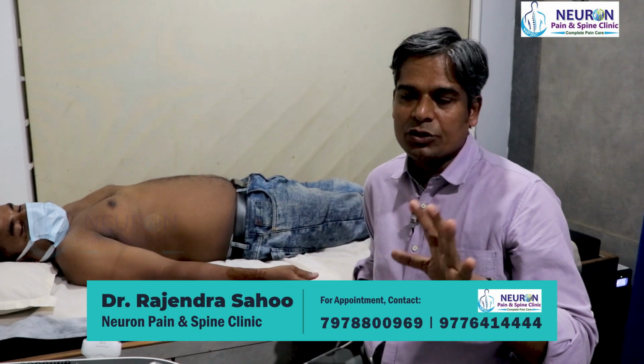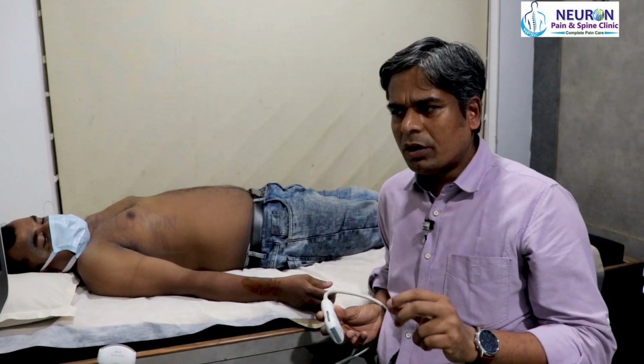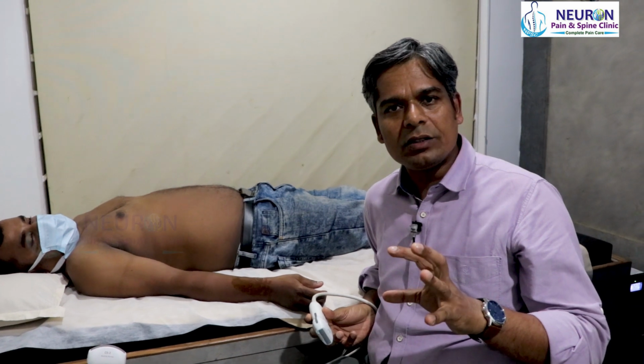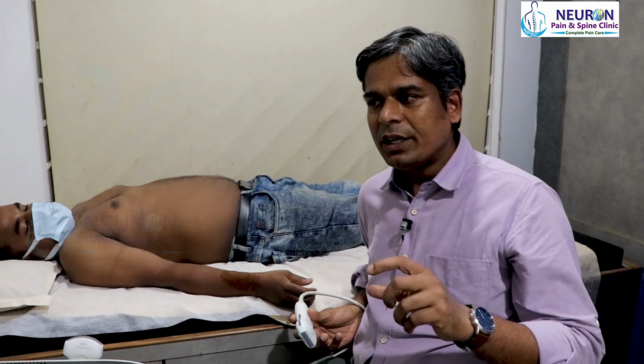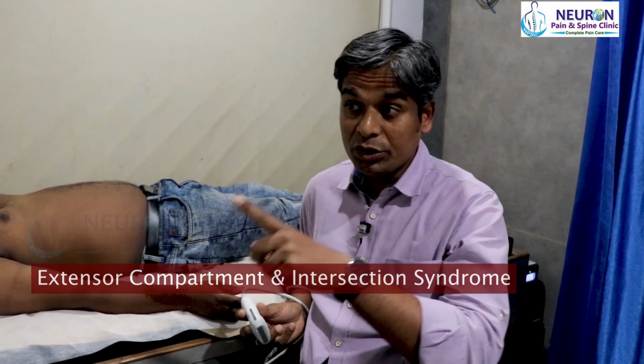So I am going to show you the extensor compartments of the wrist. There are 6 compartments, we know. A few pathologies that we come across in day-to-day practice: one is de Quervain tenosynovitis of the first extensor compartment. There is something not very common, that we call intersection syndrome. That I am going to show you here.